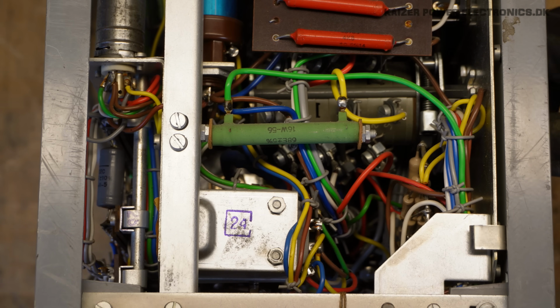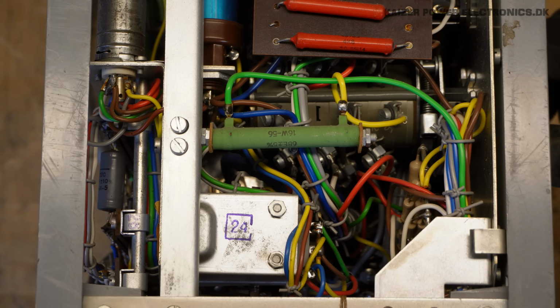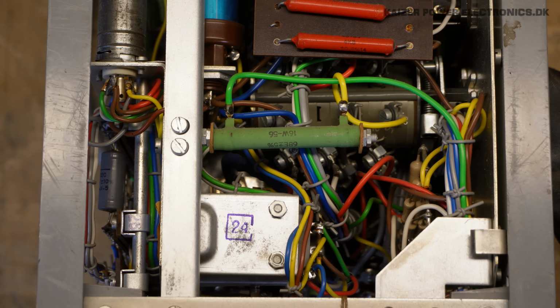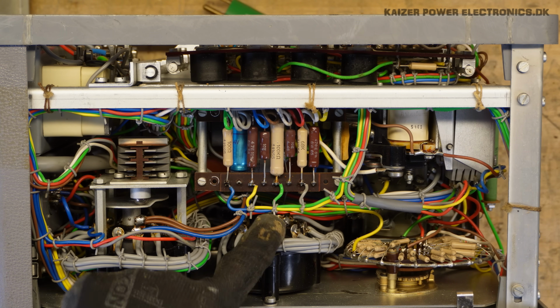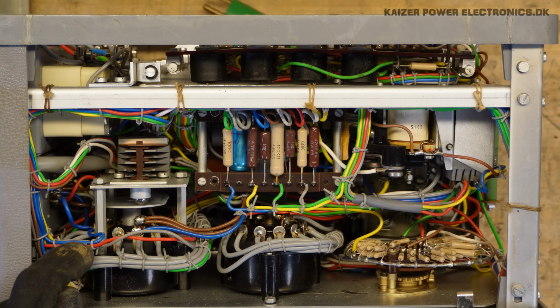From the side we can see the large on-off selector. It just rotates all the way around, selecting the mode you want, so you can actually go directly from off to small focal and over to the weird funnel thing and then to large focal point. At the bottom we have the voltage selector, and we see all the gray wires here along with these go up to the black transformer. This is also the voltage selection.